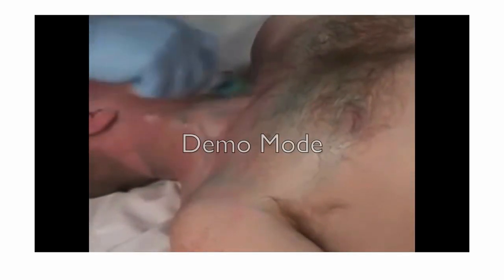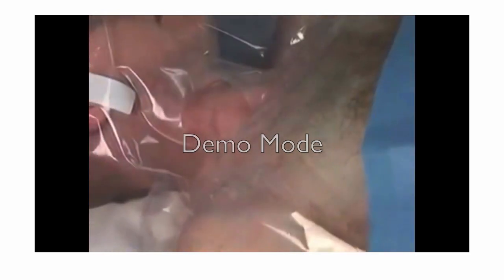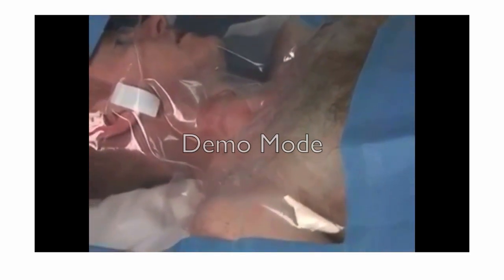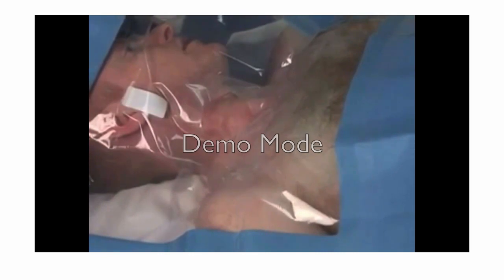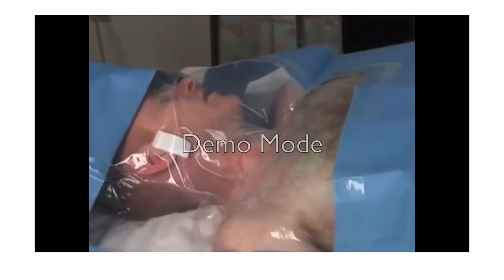Clean the area with the chlorhexidine and let it dry. Apply the drape all over the patient, and if the patient is awake, you can talk to him and explain the procedure or the next step of the procedure.